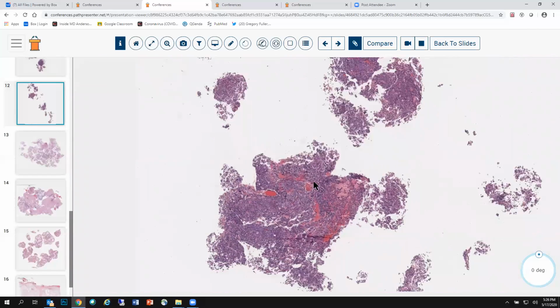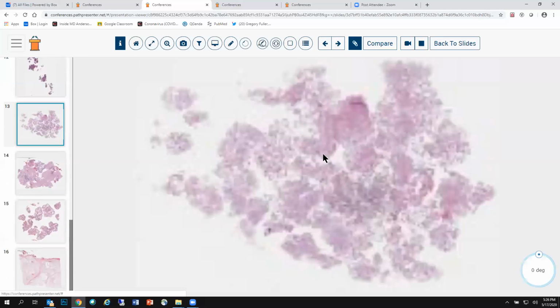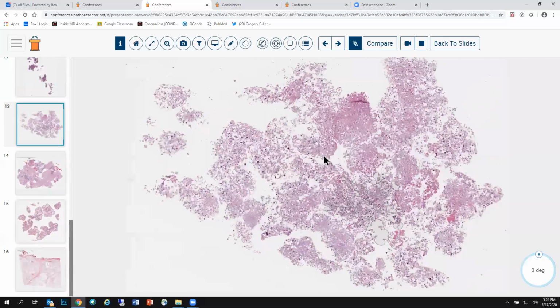Again, the principle is you must perform this on every pituitary adenoma, regardless of the serum status, the levels. You should run all of the pituitary hormones, and it is a good idea to run CAM 5.2 as well to classify. All right, moving on to unknown case number 13.